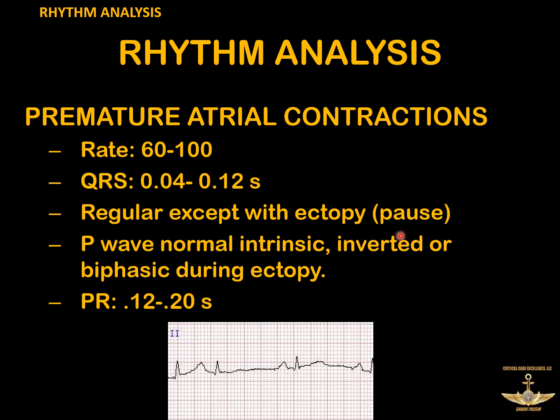Premature atrial contractions, or PACs. This is an addition to the underlying rhythm. So we're going to have to talk about this in terms of what the underlying rhythm is, which we're going to assume is a sinus rhythm. And then the PAC on top of that. So from the strip we have here, here's our underlying sinus beat, here's another underlying sinus beat, and then right here is a PAC. So it's an additional early atrial beat that did not come from the sinus node.